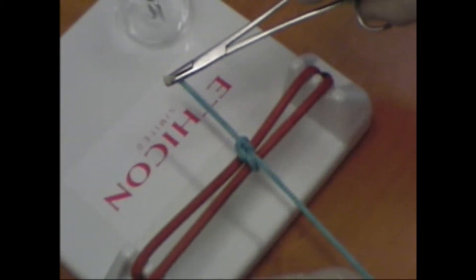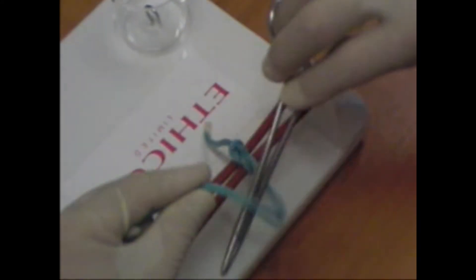An instrument tie is often used on the skin and for delicate, accurate suturing, such as intestinal or vascular anastomosis. Surgeons often put a double throw on the first tie to prevent the knot slipping.